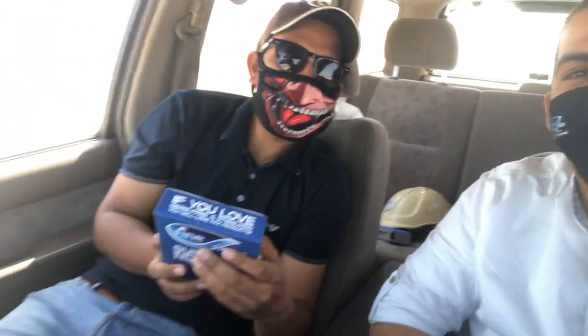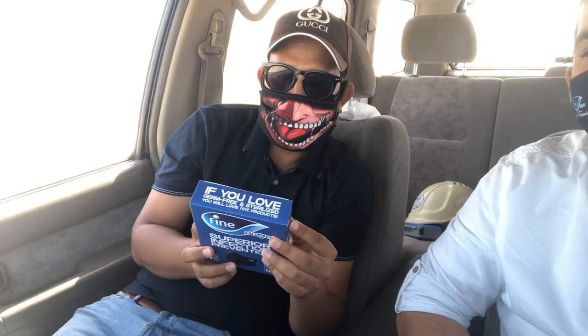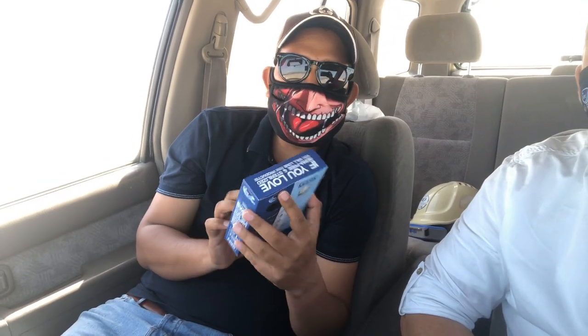Bismillah ar-Rahman ar-Rahim. Assalamu alaykum wa rahmatullah. We are going to review this mask. This is FineGuard N95 — Marks Superior Infection Prevention.